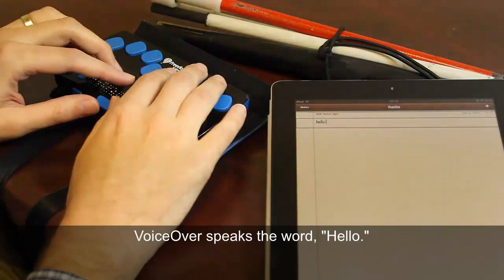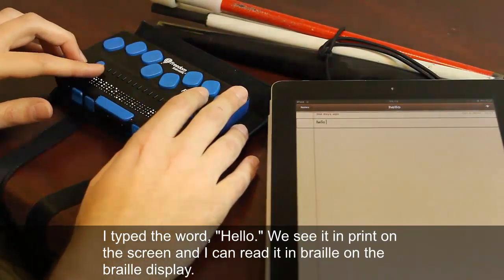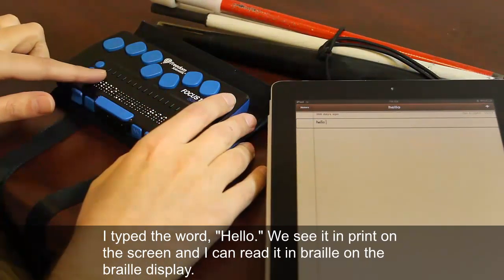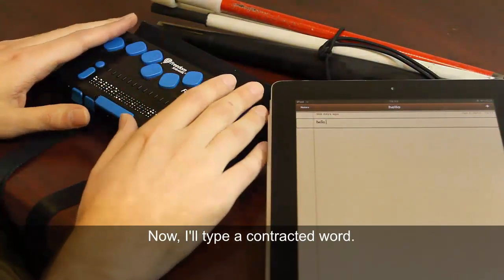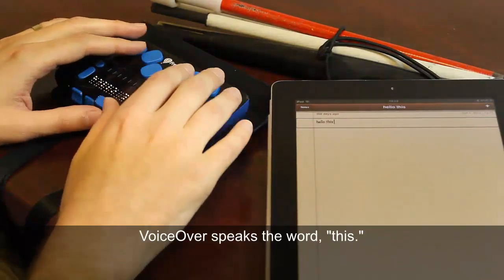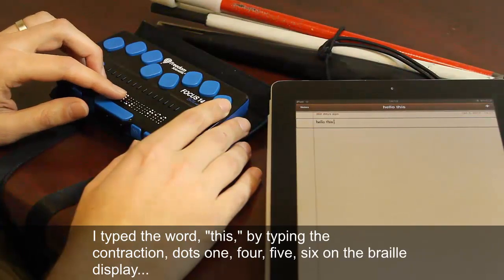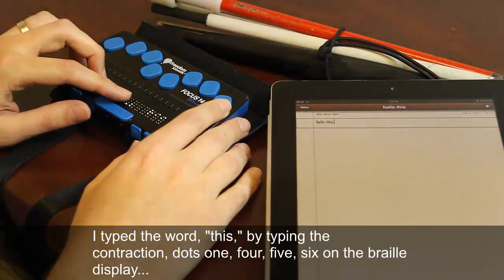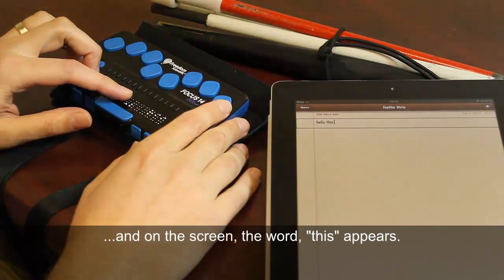I type the word 'hello' and we see it in print on the screen, and I can read it in Braille on the Braille Display. Now I'll type a contracted word — 'this' — by typing the contraction dots 1, 4, 5, 6 on the Braille Display, and on the screen the word 'this' appears.